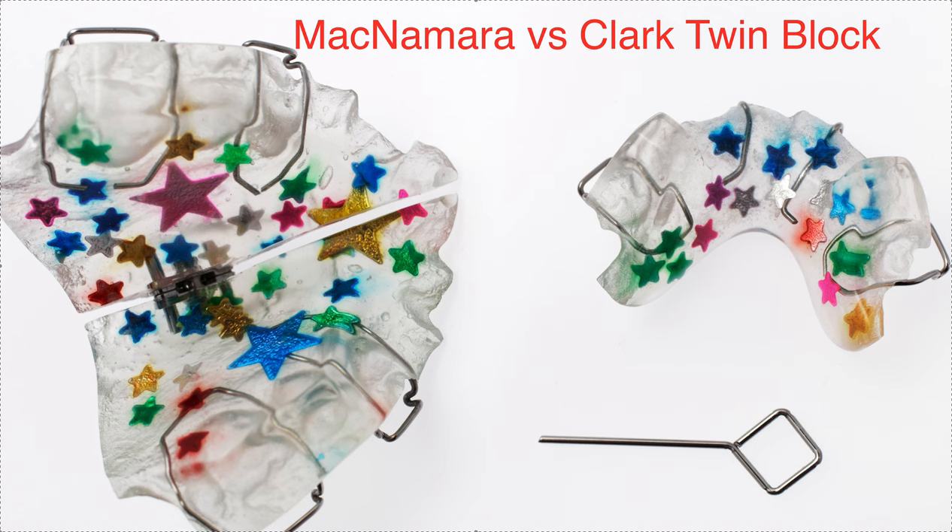I found out that different labs call different twin blocks different things with different features. Based on my knowledge, a Clark twin block was always a twin block that didn't have any type of screws in it. You can see this one has a screw in it. And a McNamara twin block was one that had a screw in it, so you'd call this an upper McNamara twin block, although usually both upper and lower have screws. I've never seen one that was like this, but this is the photo that I had. A Clark does not have screws in it.